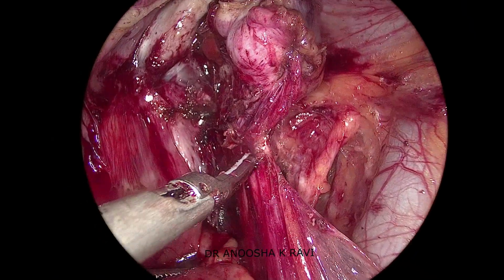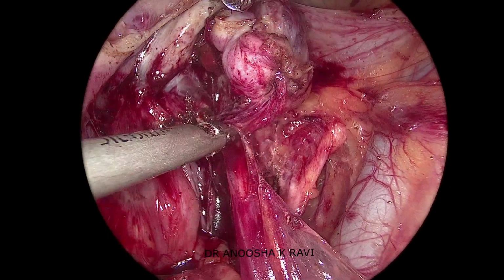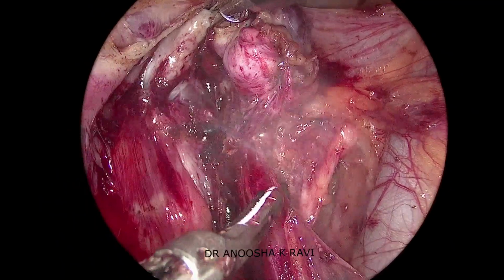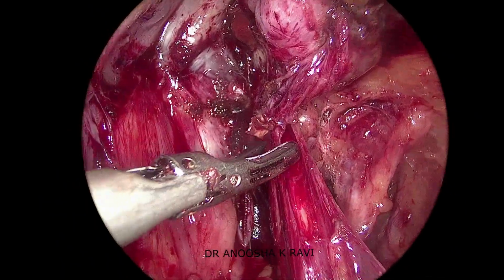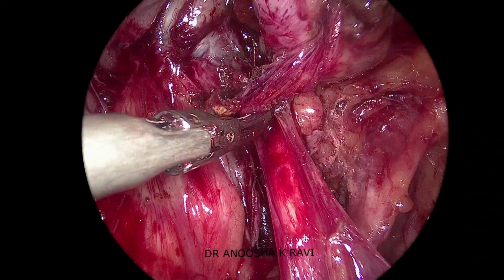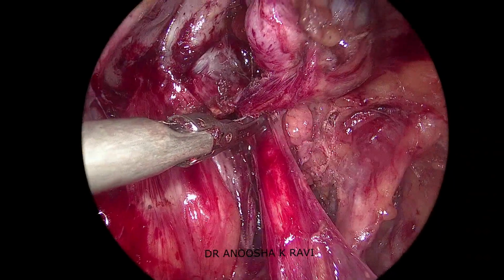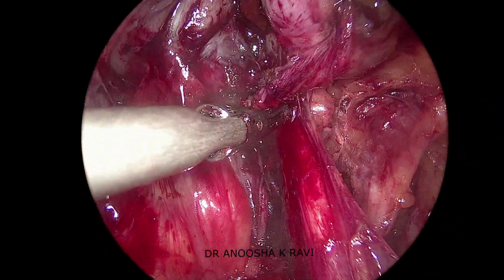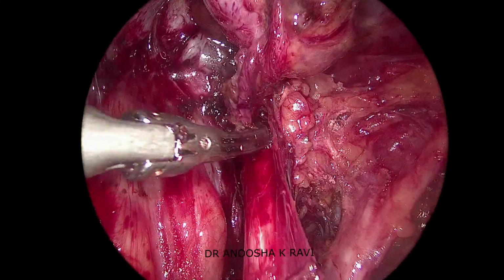Now with lifting up of the right adnexa, ureter is further separated from overlying adhesions. This step of lateralization of ureter is called ureterolysis, and this forms a very critical step in such cases. This is proceeded up until ureter is seen entering the ureteric tunnel.